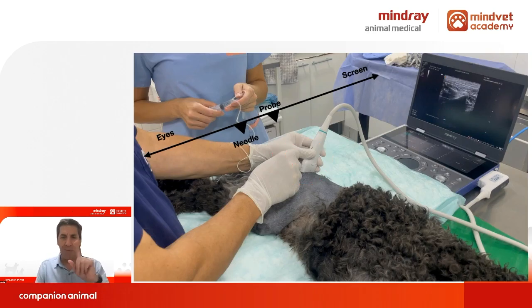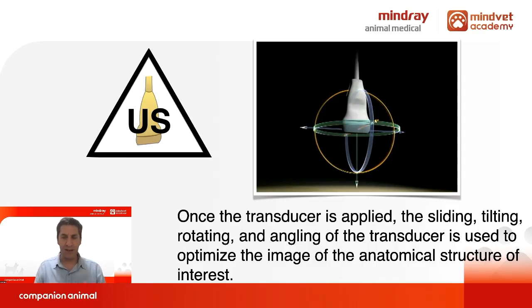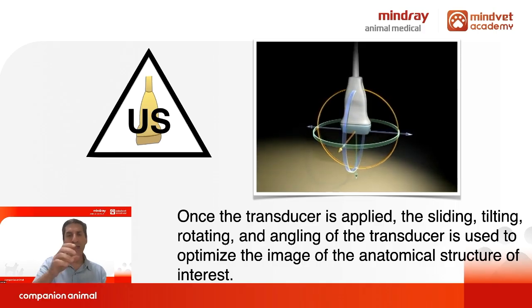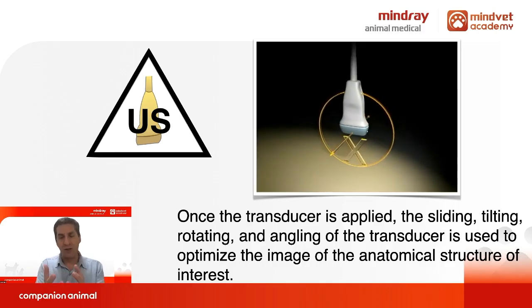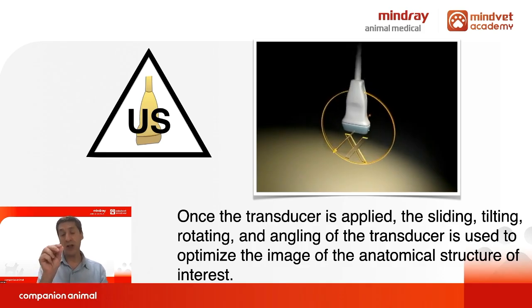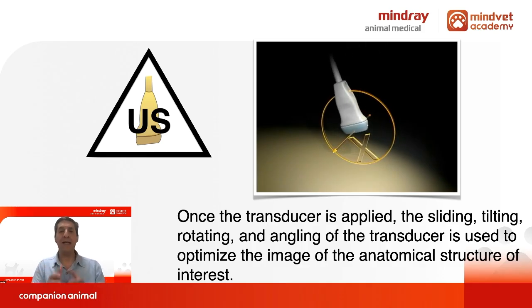Okay, I mentioned before that we have 3 dimensions, but we only see 2 dimensions on the screen. And I already mentioned that the movement of the probe will help us to reach this structure, this space, this landmark, which is not present on the screen.